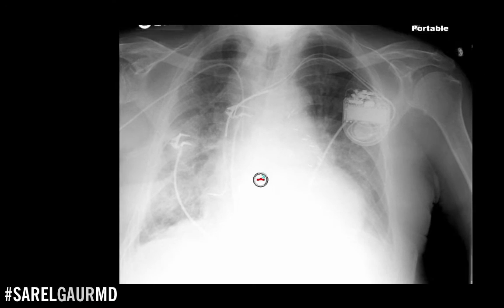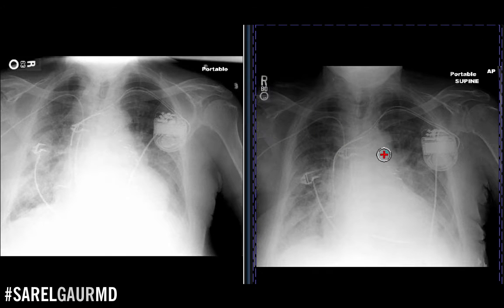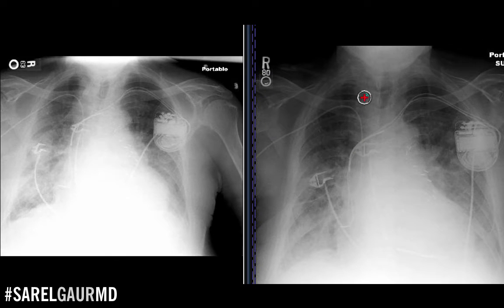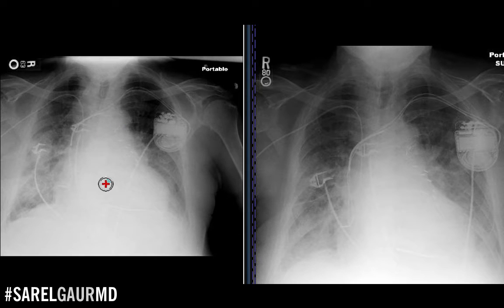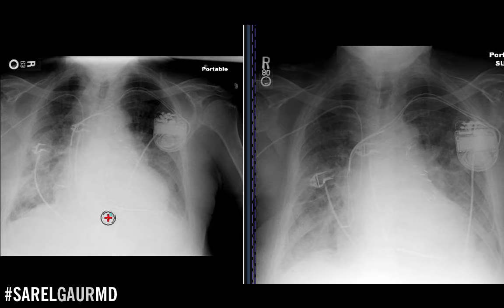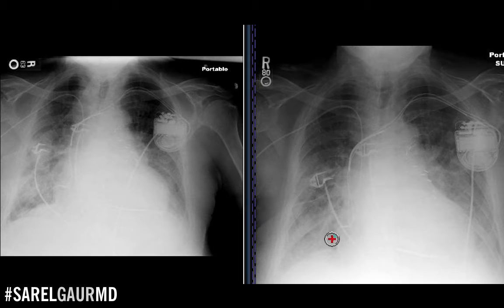Now I'm going to compare with the prior exam. I have a prior study here on the right. Basically the question is whether the failure is better, worse, or the same. Basically stable bilateral lower lobe parenchymal opacities with bilateral at least moderate pleural effusions — no significant interval change.